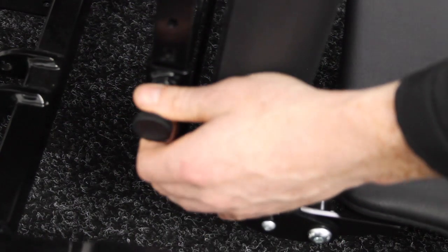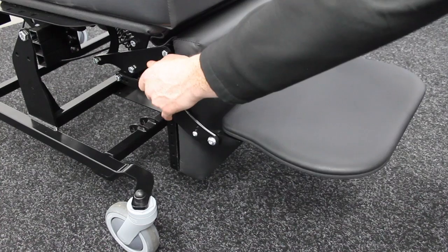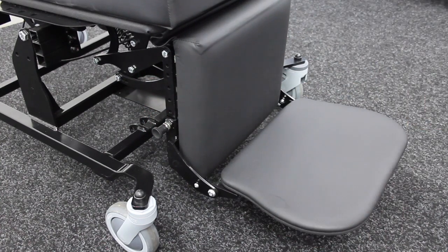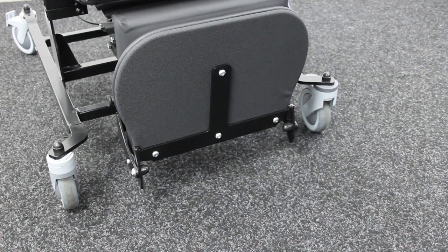To adjust the height of the foot plate, pull both spring plungers at the side of the foot plate simultaneously. Release these and allow the foot plate to click into place. For standing transfers, you can simply move the foot plate as shown.